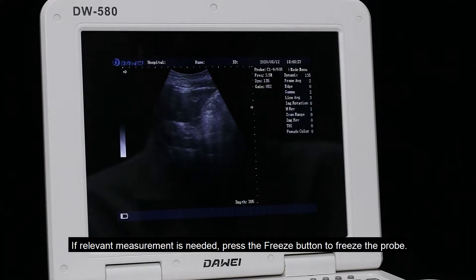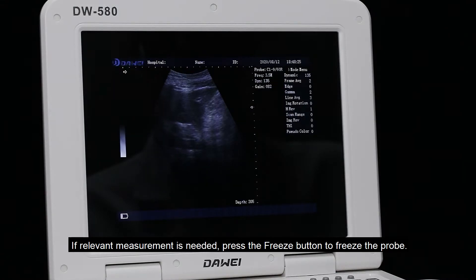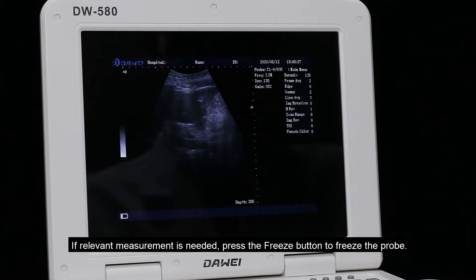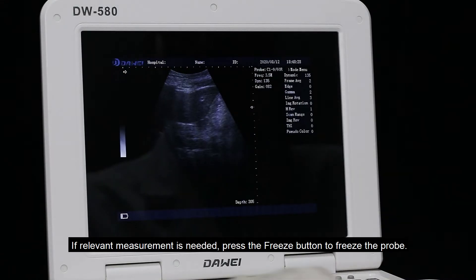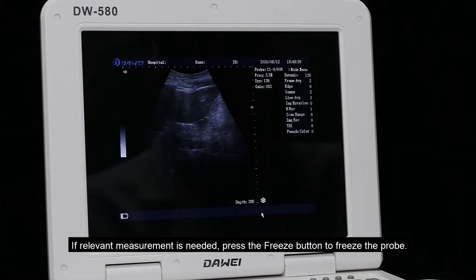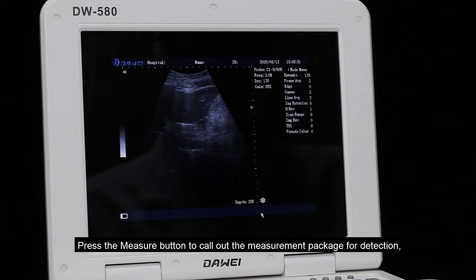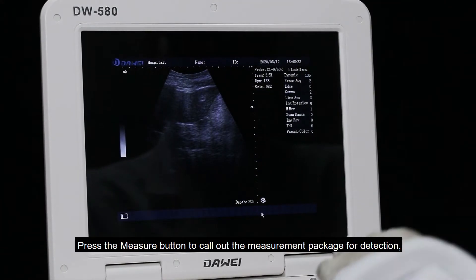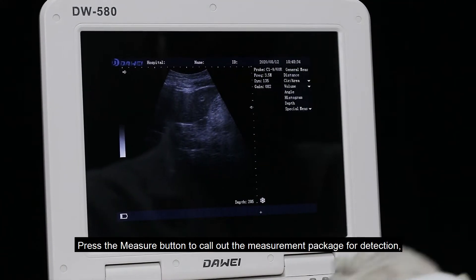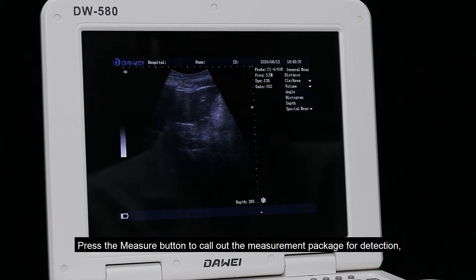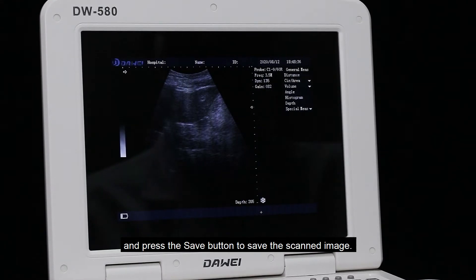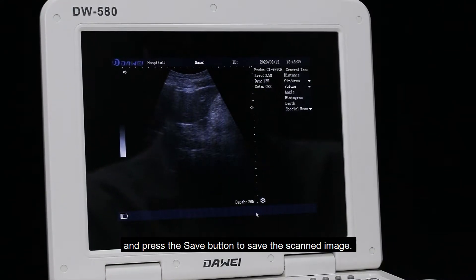If relevant measurement is needed, press the freeze button to freeze the probe. Press the measure button to call out the measurement package for detection, and press the save button to save the scanned image.